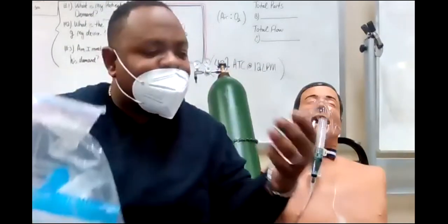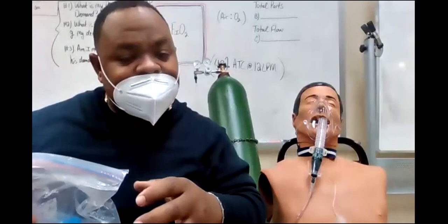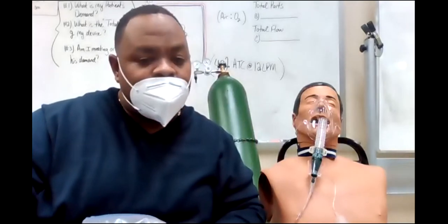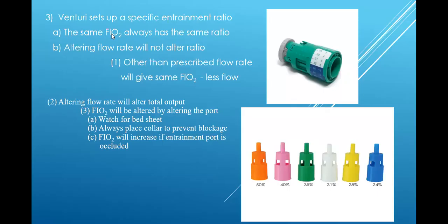So that's the Venturi system, right? The Venturi device, which is the first high flow system. Okay. All right, now I'm gonna show you some different ones that they show you in the PowerPoint. Same exact principle. So what does it say about Venturi?